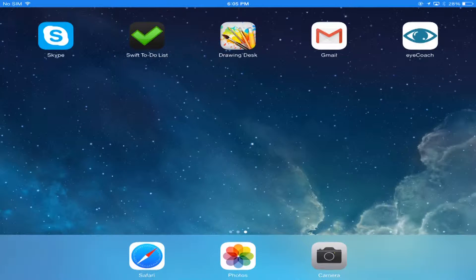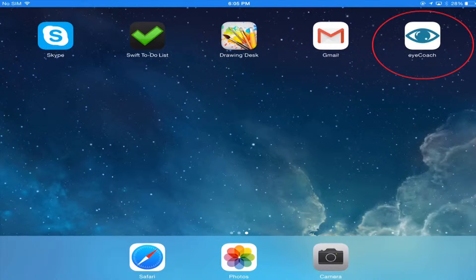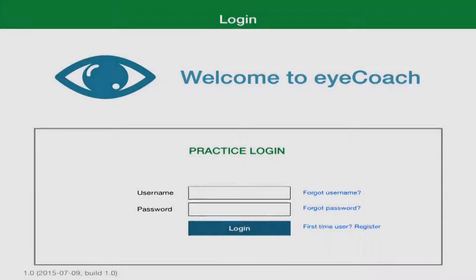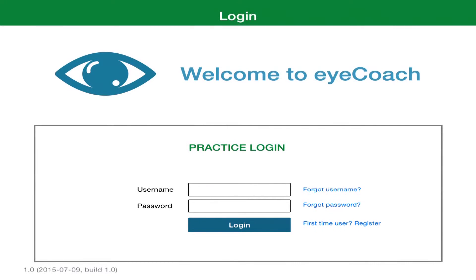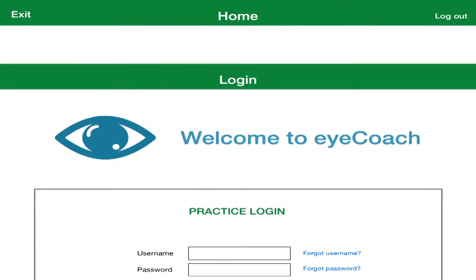Find the iCoach app icon on your iPad and touch it to open iCoach. You are taken to the Welcome to iCoach screen. You can set up your username and password later. For now, simply touch the dark green bar at the bottom of the screen marked Log In to get started.